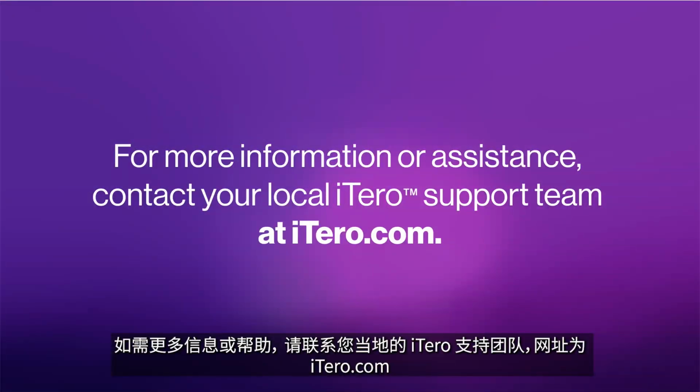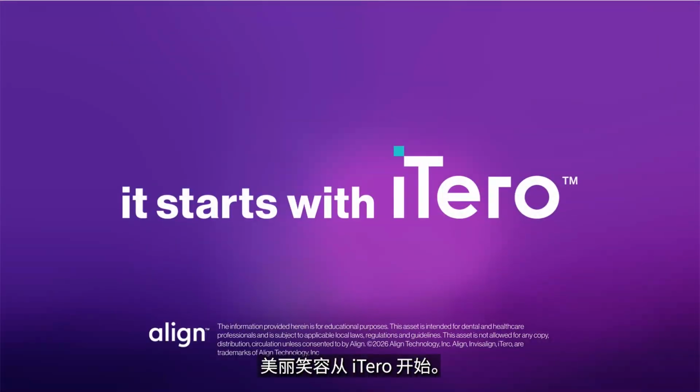For more information or assistance, contact your local iTero support team at iTero.com. It starts with iTero.